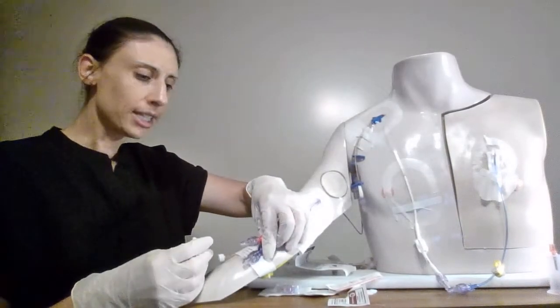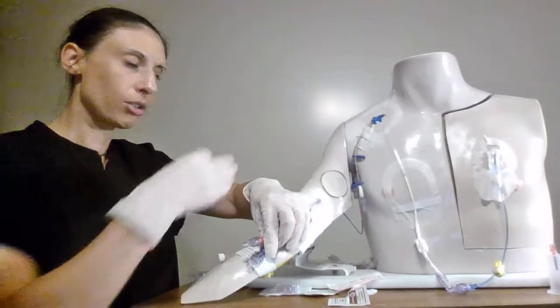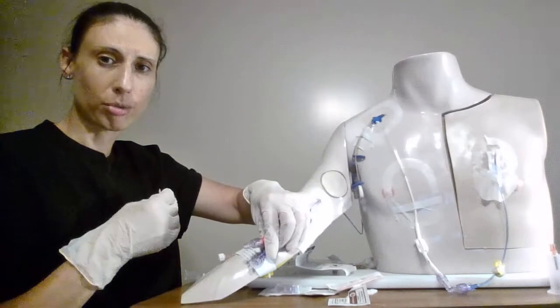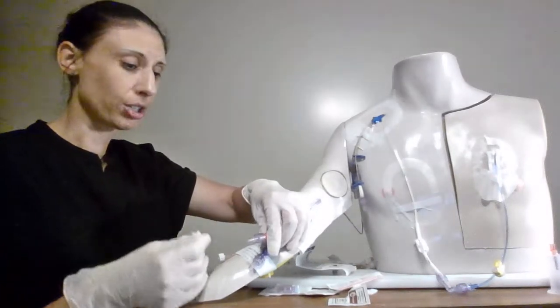Sometimes PICs can be a little bit finicky in that because they're so long and they're a smaller diameter it is hard to get blood return and sometimes they are hard to flush as well.